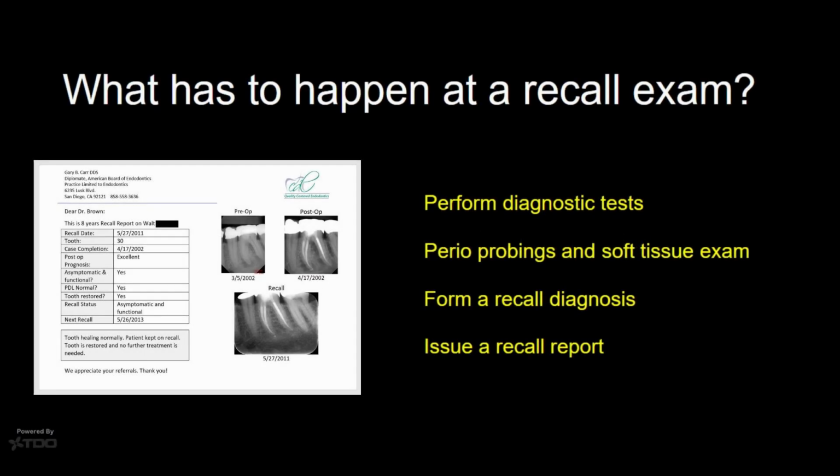Let's think carefully about what has to really happen at a recall exam, besides just taking a radiograph. Well, you have to perform all the diagnostic tests: percussion, palpation, mobility. You have to do the periodontal probings and a soft tissue exam. Then you have to form a recall diagnosis of how the tooth is doing, and then you have to issue a recall report.